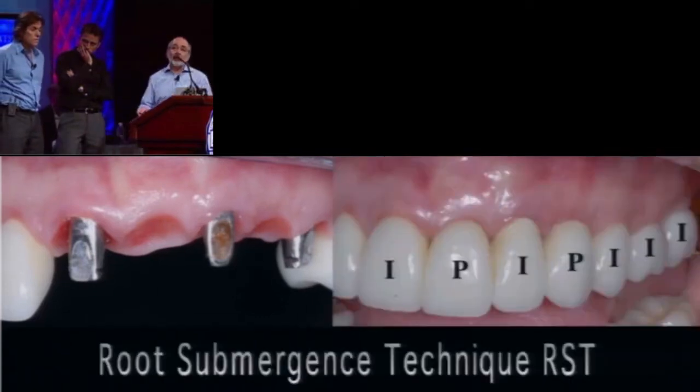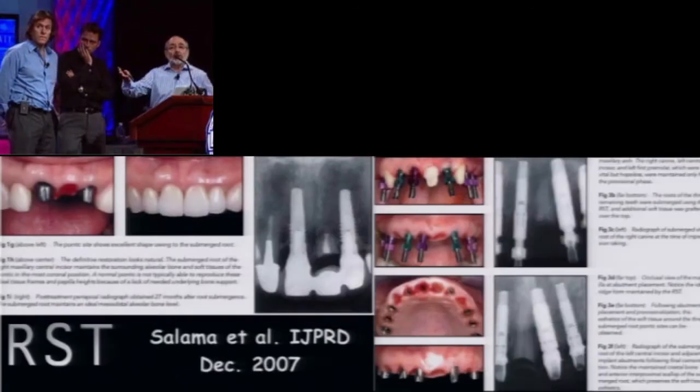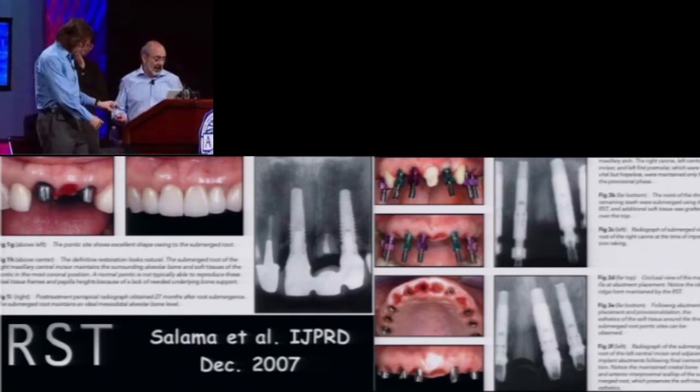And you now have pontic, implant, and whereas we move back, we choose to put more implants where it moves beyond the aesthetic zone. Again, submerged roots, and this is the article, access it on Dental XP. It's there as a PDF, rapidly download.